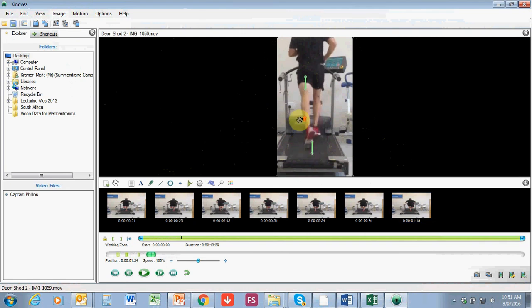I'll play a few frames forward just to see where his heel recovers. So when you look at this, again mid-heel, right, almost perfectly in line. Okay, so this is a much better heel tracking than it was on the right side. So again, I would screen capture this, and then it allows you to do left side, right side comparisons. Okay, so I'll just go delete these.